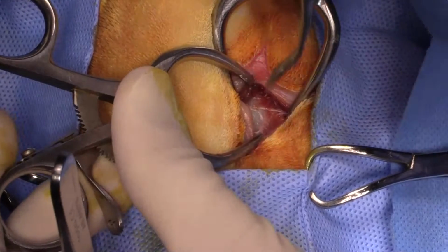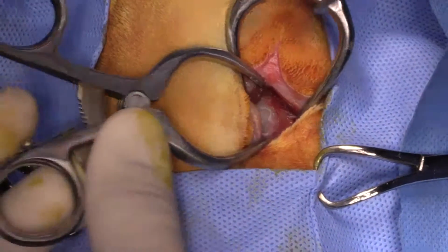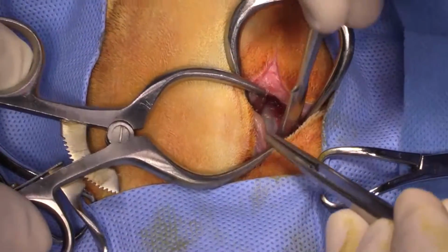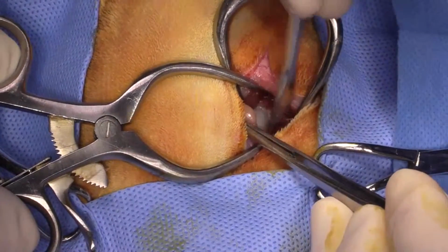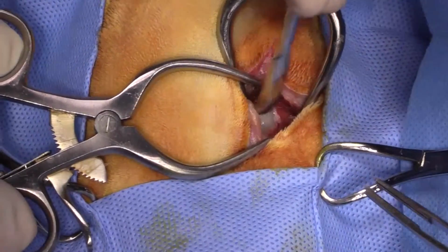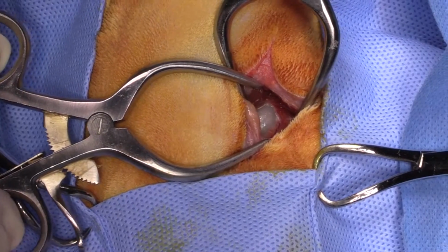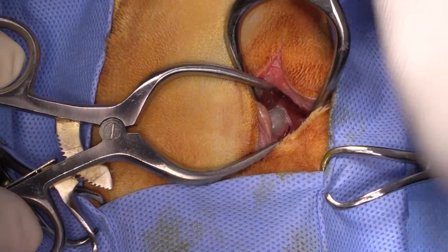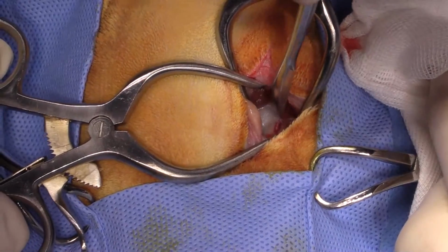Okay, so that's my bulla sitting right in here. Can you retract on that for me, please? Thank you. Eddie, can you look at the screen and see if you can see the bulla? All right, so that's the nice shiny white bulla right there. Hopefully you'll be able to see that. And again, when we go to the other side, you'll be able to see it even better. What we're going to do is use an intramedullary pin to perforate the bulla.